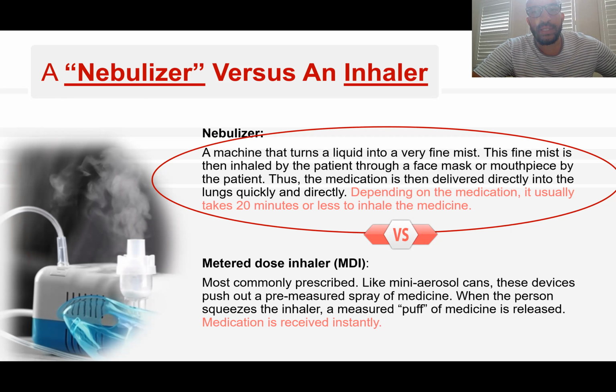But adult patients who are living at an assisted living facility or in a hospital or in an acute care facility, we can easily keep a nebulizer machine there. We can set it up for them, teach them how to set it up, and administer this medication fully without worrying about them getting up or leaving or not following the instructions or not being able to sit still for the full duration of the treatment.